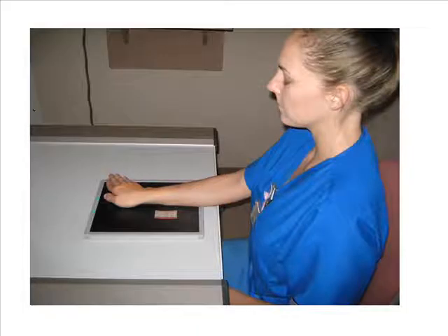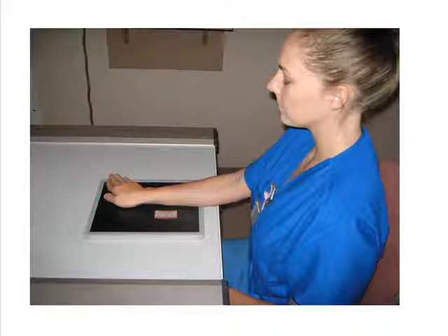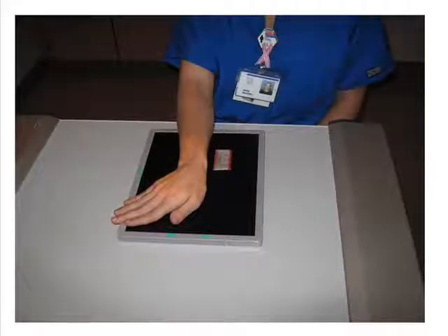The PA projection of the wrist with ulnar deviation is performed with the patient seated at the end of the table. A lead shield should be placed on the patient's lap for radiation protection. The height of the table should be adjusted so the patient's arm and forearm rest easily on the table. The patient's pronated wrist is centered on an 8 by 10 inch image receptor.